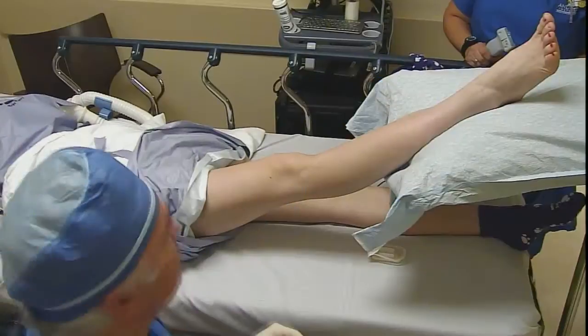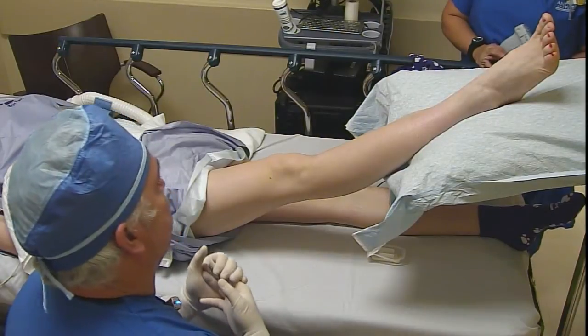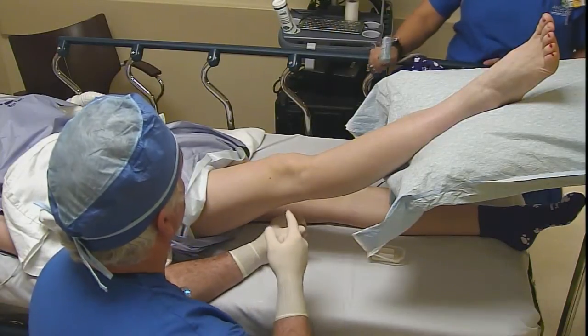We do these sometimes in a lateral position, sometimes we do them in a supine position with the foot elevated, and that's what we're going to do today. As you can see from this position, I'm sitting at her side with her foot elevated on a Mayo stand with a pillow, and we're going to bring the probe underneath and come in with a lateral approach with our needle.